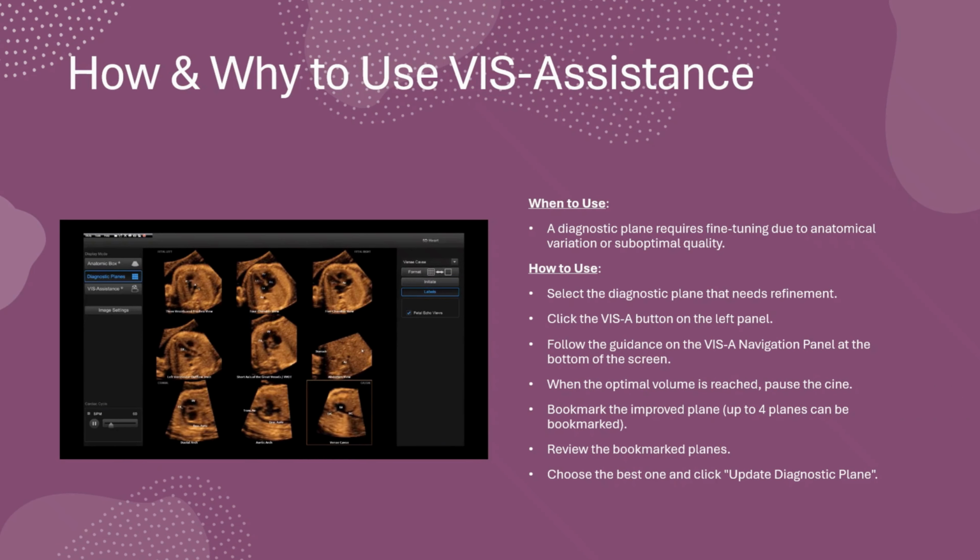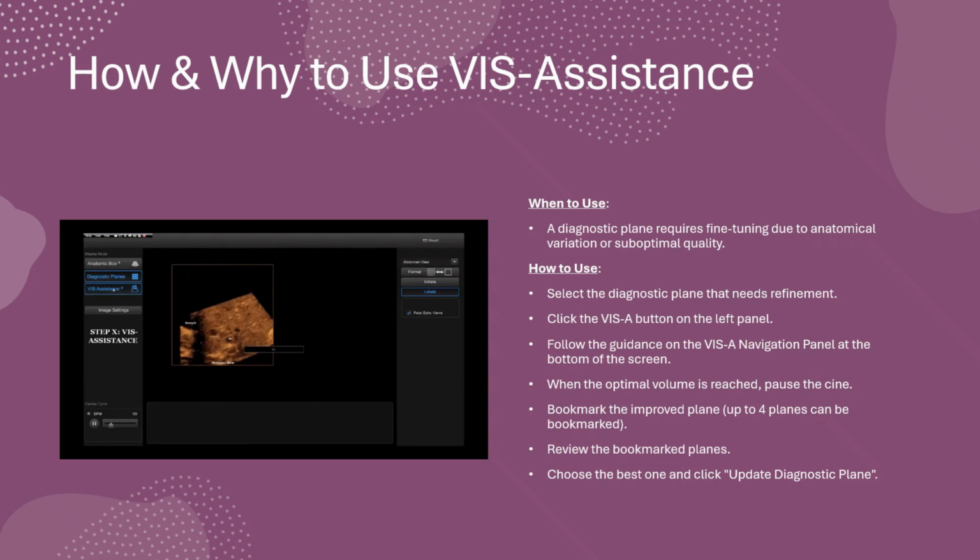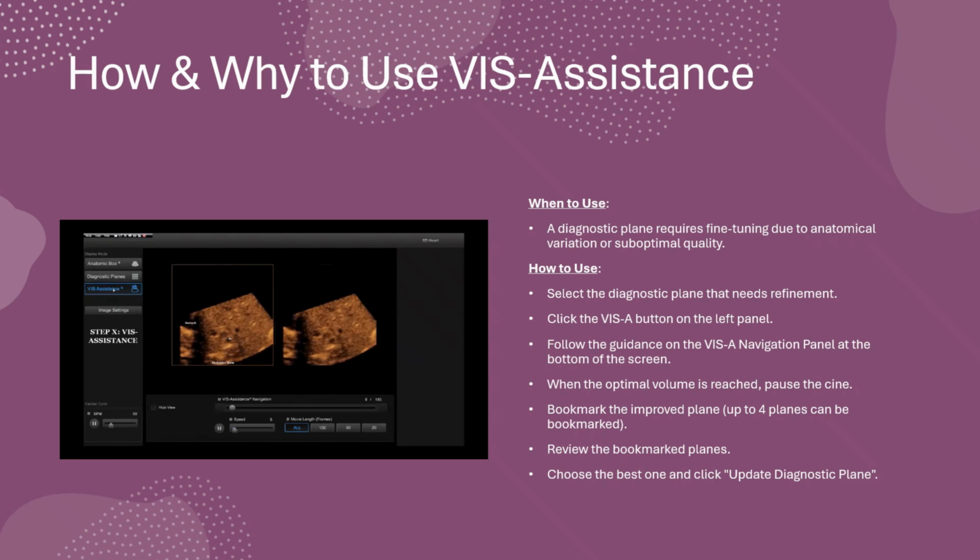So when should you use VIS-Assistance? It's most useful when your diagnostic plane needs fine-tuning, maybe due to a subtle anatomical variation or just less than ideal image quality. That's your cue. Now here's how to use it step by step.